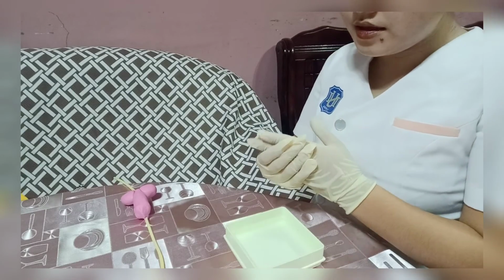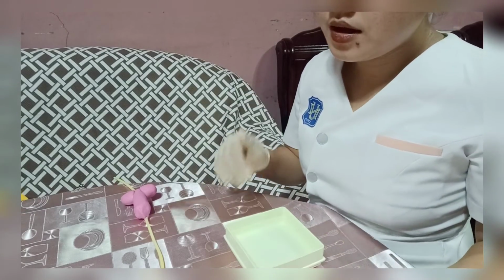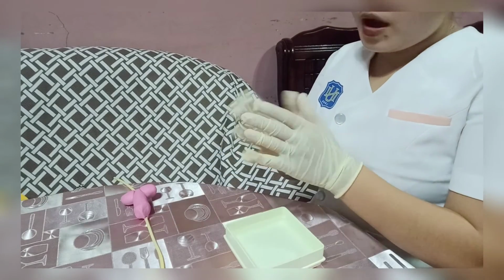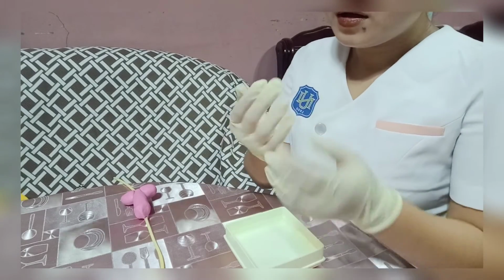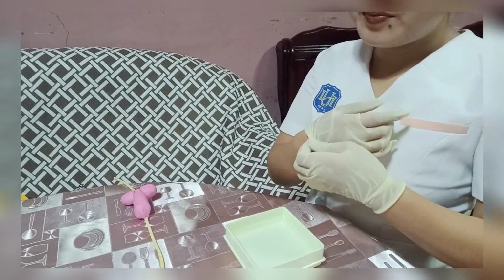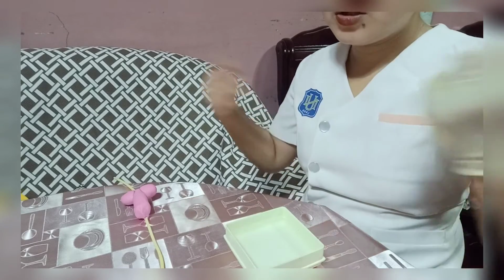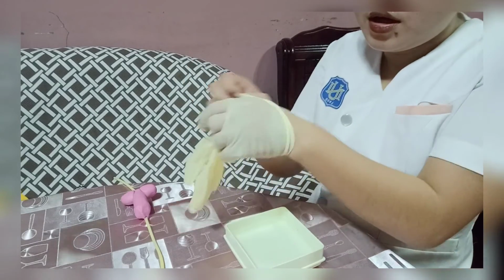Put away the materials we used in the procedure for male and female patients, and remove our gloves in appropriate receptacles to prevent infection and contamination.